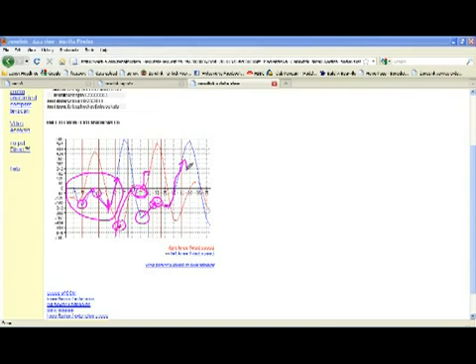Pulls off the ice pretty well on the left side, but what we're seeing here is a breakdown in pattern, pretty significant breakdown in pattern at the knee, where the extension speed occurs way early prior to heel strike. We don't get the same lull, extension, acceleration we would expect mid-stance to toe off, although we are getting a pull. The push is almost non-existent, and the pattern is definitely disrupted.